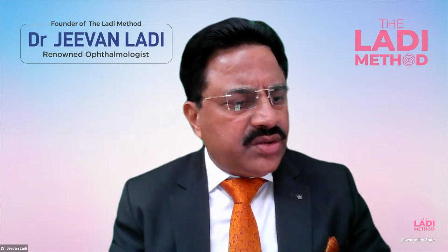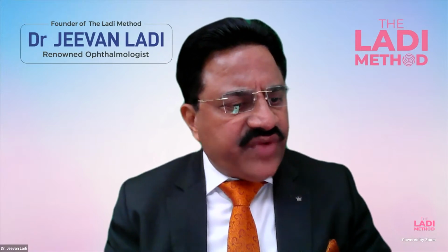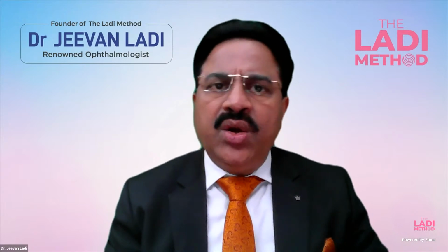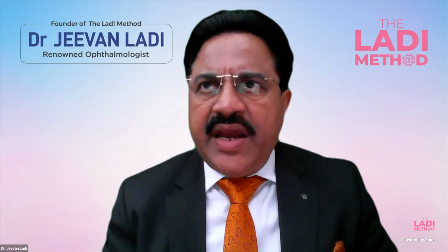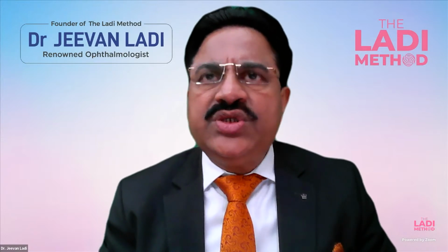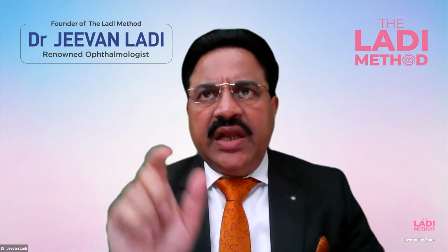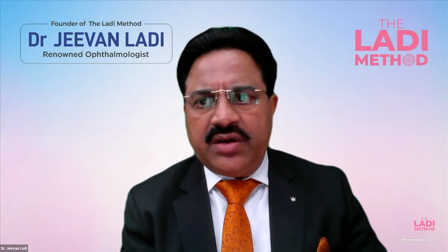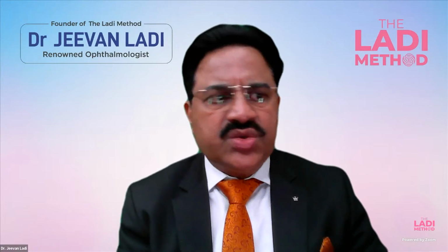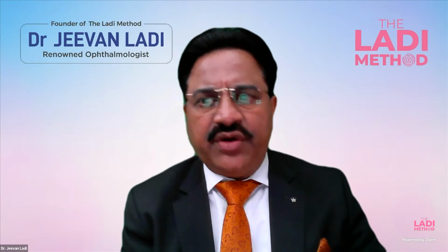There is a question from Dr. Tushar Mani, and this is a very valid question. Lens factor or A constant will not differ in the Ladi method. No, it will not differ. In Barrett Universal, you are not supposed to feed in lens factor. Once you put the A constant in the A constant box, lens factor will come by default. Even if you try to put something there, it will not come. So once you put the A constant there, the readings will come automatically by default.